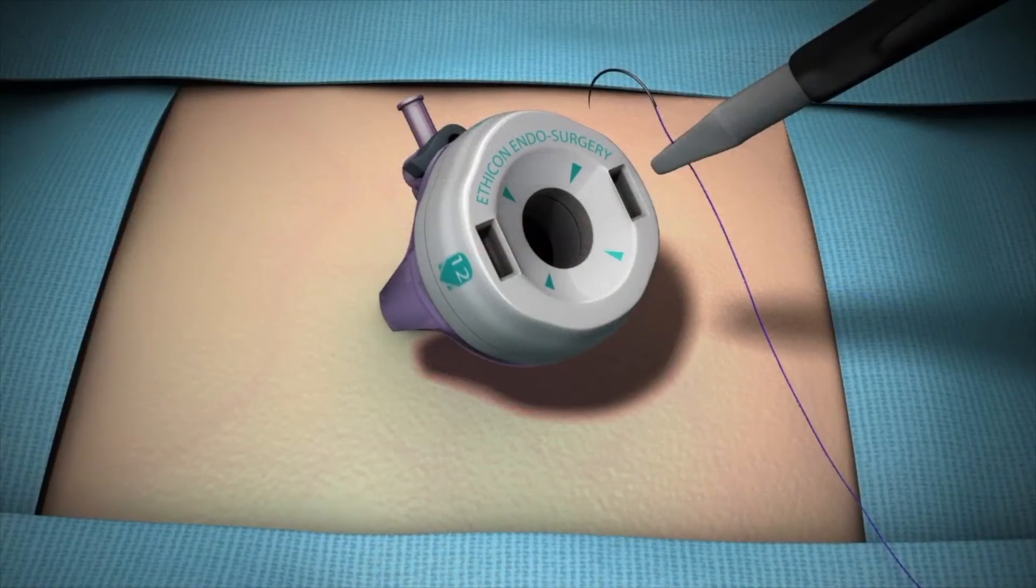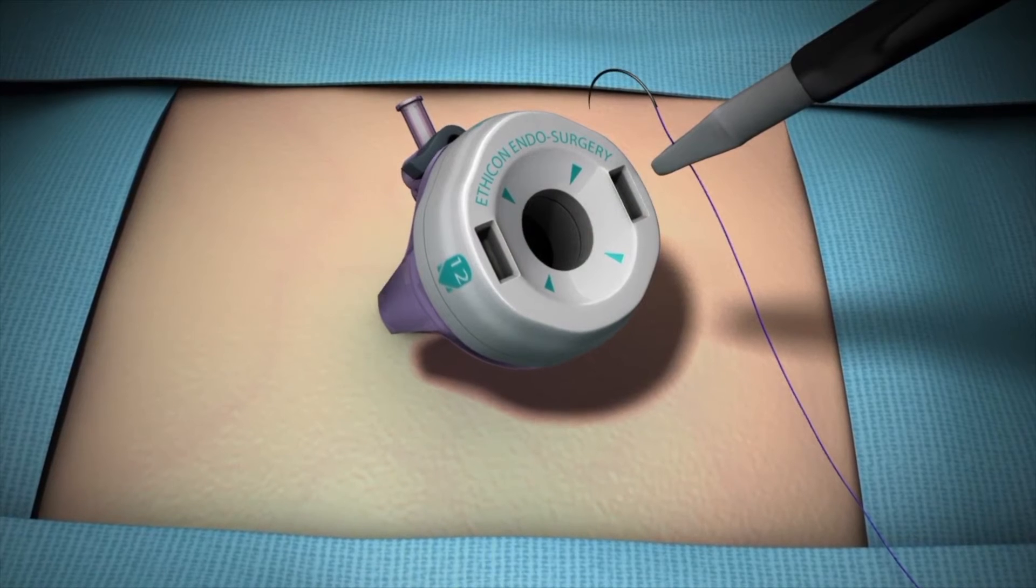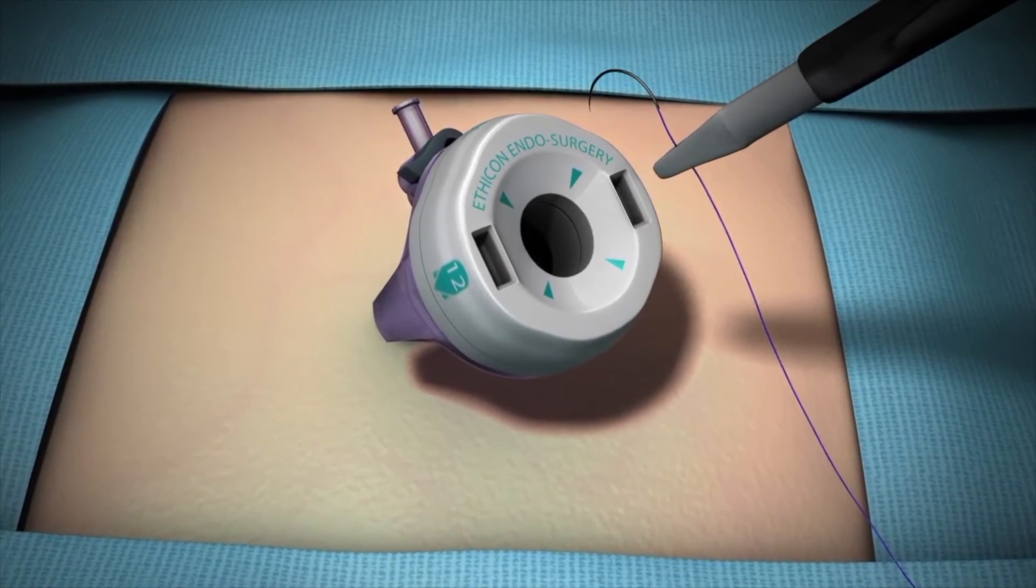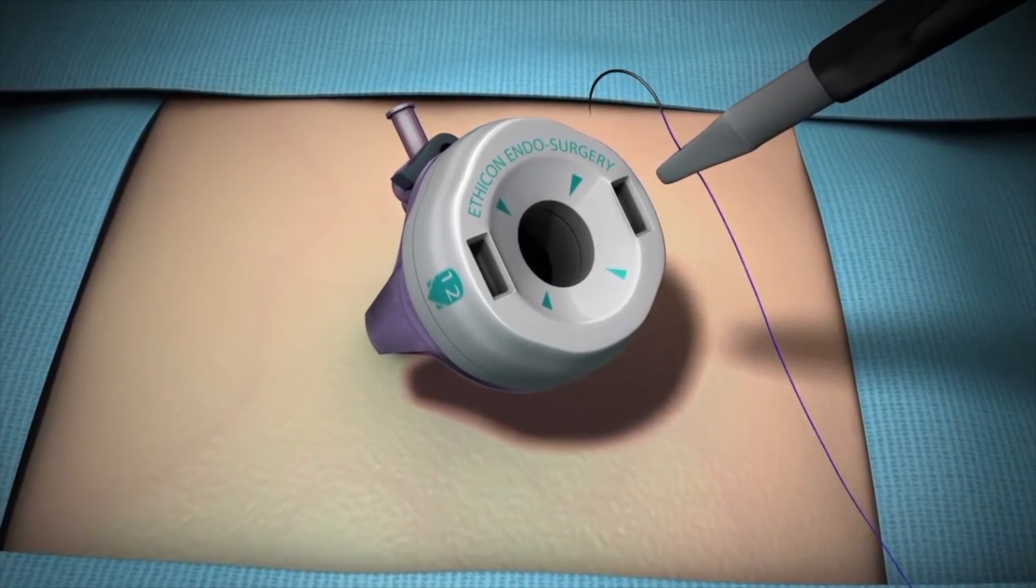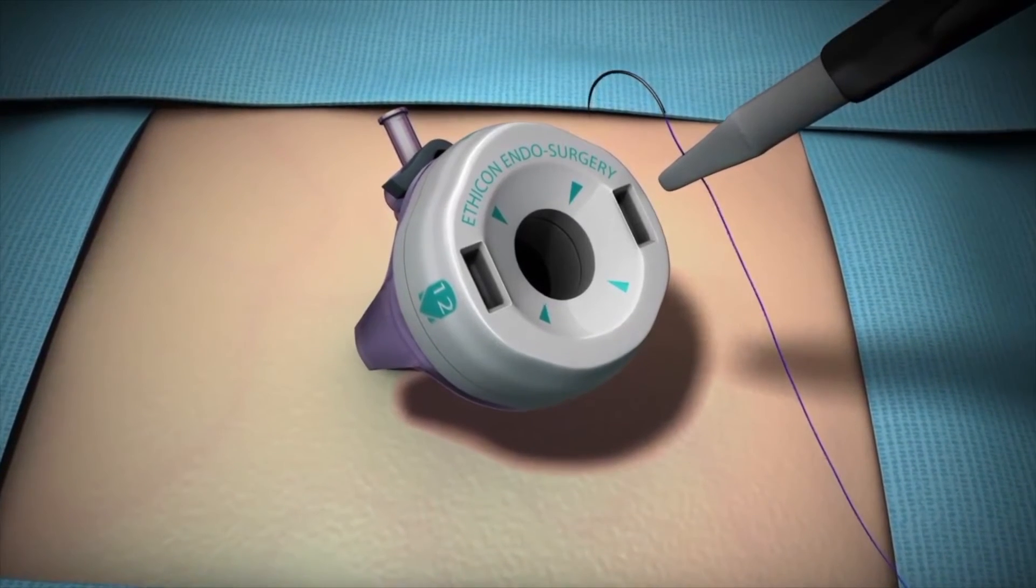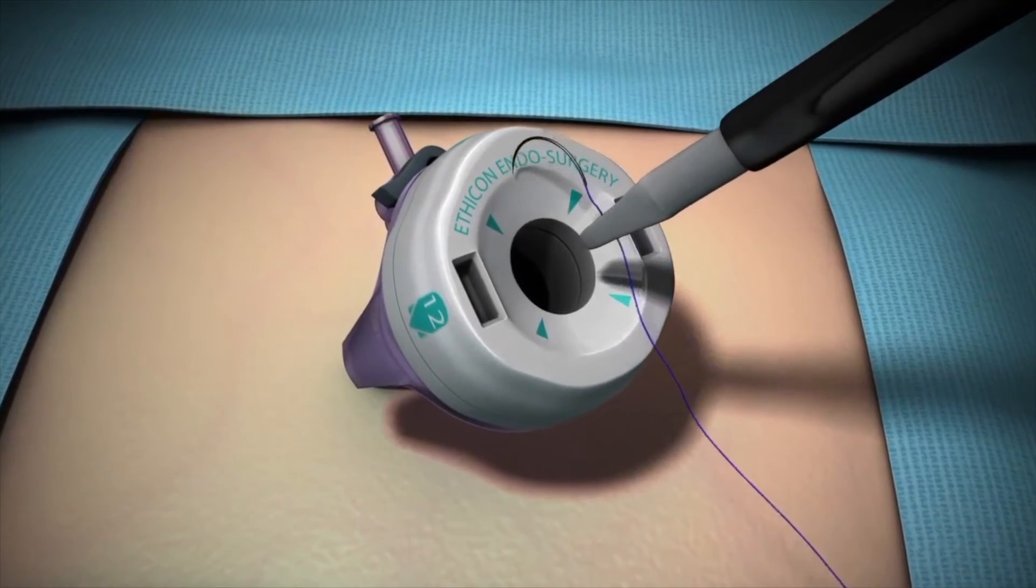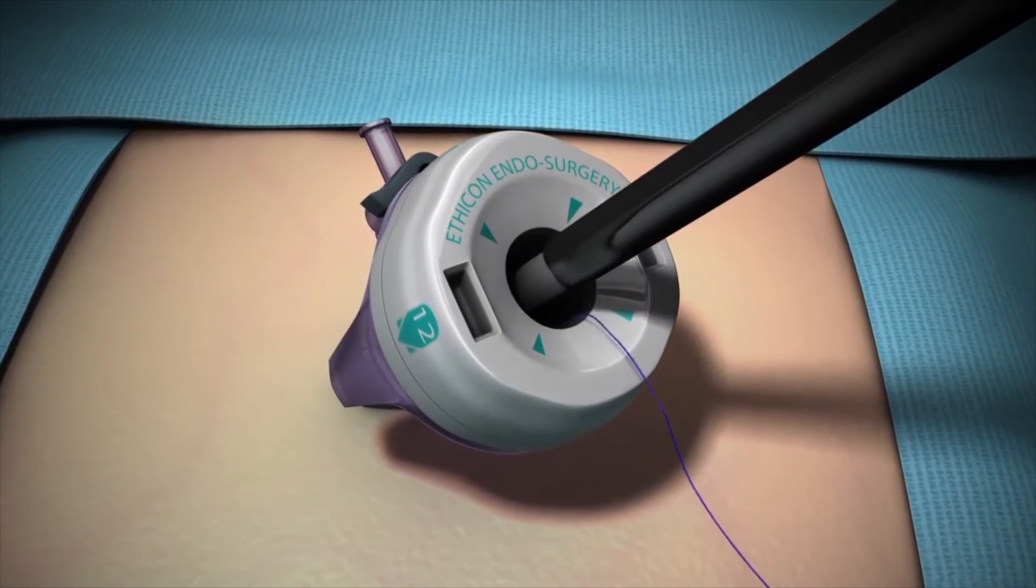To use the Stratafix Spiral Devices in a laparoscopic procedure, grasp the leader zone of the device, located approximately one to two centimeters from the needle's swage. Using the needle holder, insert the Stratafix Spiral Devices through the trocar.